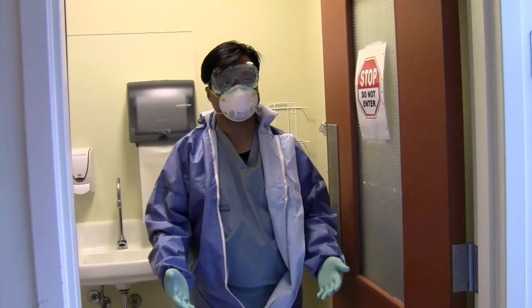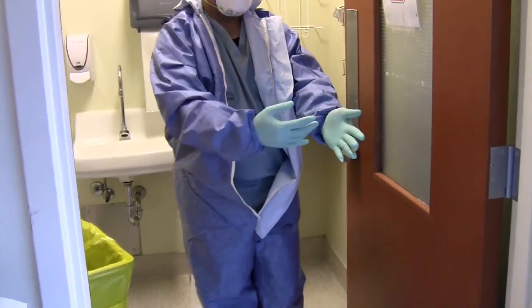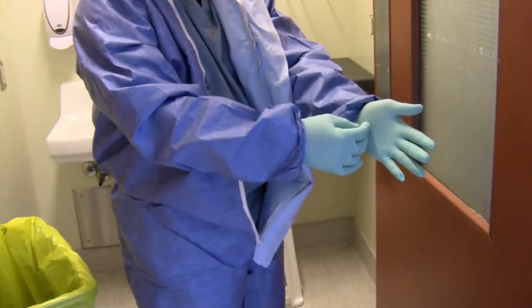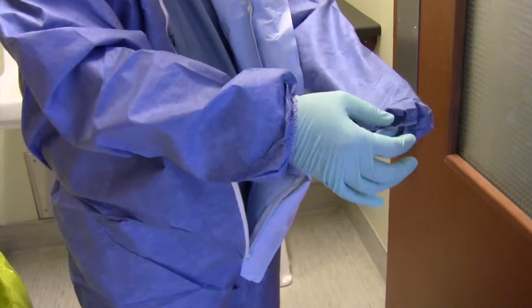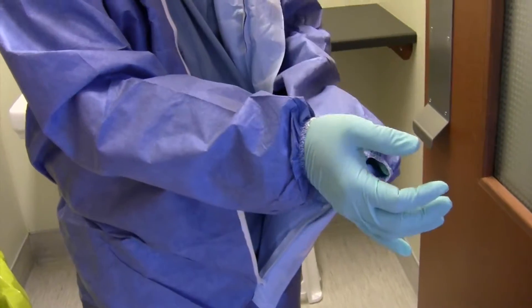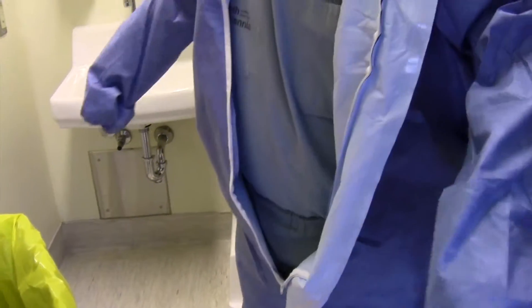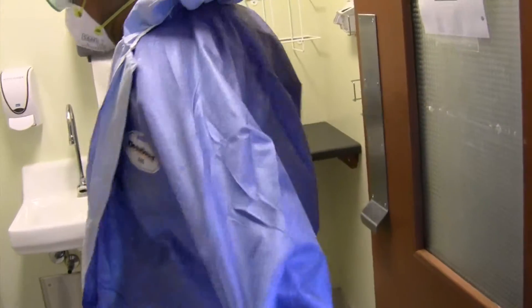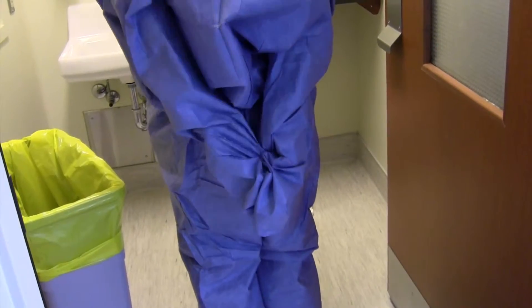Step 9: Remove coverall and discard. To remove the coverall, pull gloved hands inside the coverall sleeves by grasping the edge of the coverall sleeve and pulling your arm inside. Repeat with the other arm. Next, grasp the coverall sleeve from behind your back and pull off your shoulders.